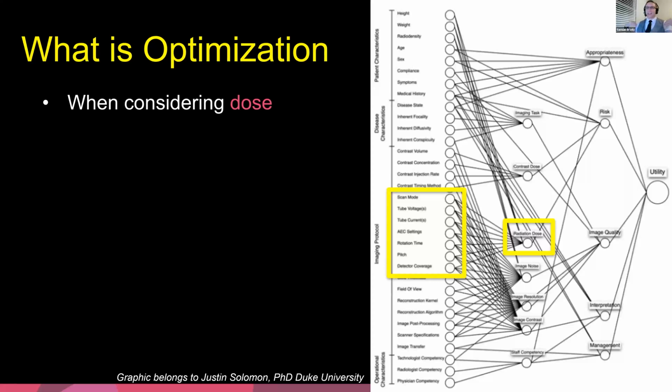Probably the most tricky, now that I think about it, and I probably should have included a slide on it, is the neck. And that's because if we're doing C spine imaging, well, C7, it's actually down here. And so there's a lot of shoulder involvement when you're trying to image C6, C7. And so typically we're going to start about T1, T2, and we're going to image up through C1. Most scanners are okay, but the recommendation I would have, if you're having a hard time getting good bone conspicuity, good edge definition when you're looking at a sagittal C spine, is don't image top down, start imaging bottom up.